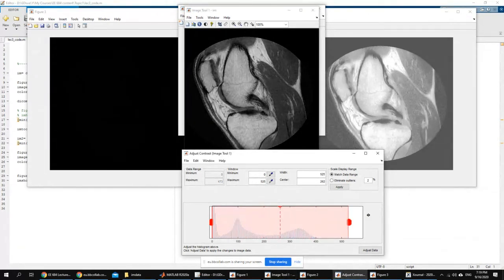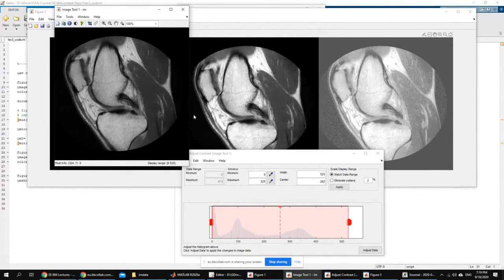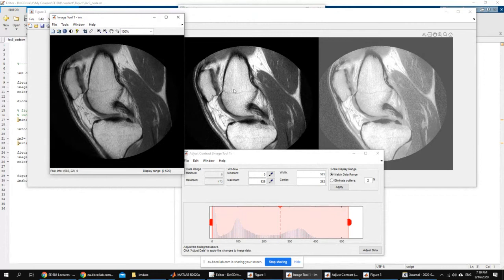See, basically, if you take the whole range, let's just display them side by side. Let's close this one. See now, this is not taking everything. It's basically adjusting the image to the end of the useful range of the histogram. Okay, so basically this is this here, not this. Even though this is okay also, this is actually not bad, but this is better because you're making the whole range of the display more useful.